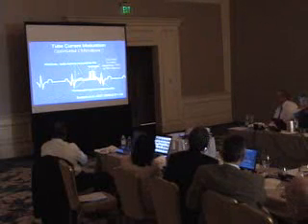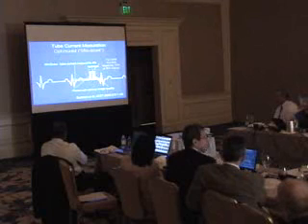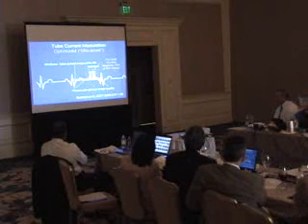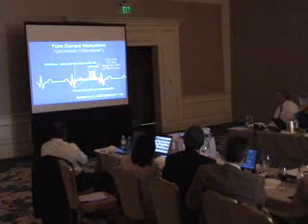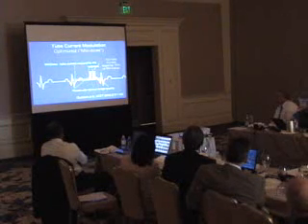We took that to the next step further, taking the retrospective technique to its maximum by having full tube current targeted only at the 70% level of the RR interval. There's a reduced tube current of 4% through the remaining part of the cardiac cycle.